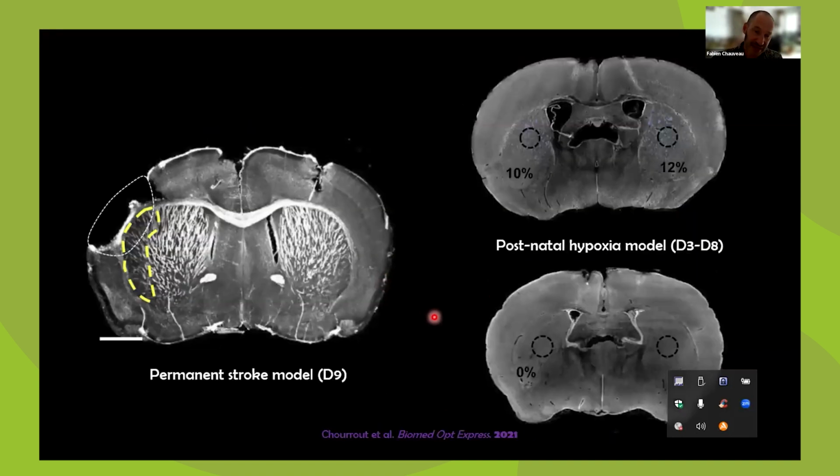A few medical cases where you can use this white matter contrast. Here in a stroke model, the lesion itself, which was necrotic, went away when getting the brain out and after the perfusion, but the necrotic part is not the interesting part. You can see here that the adjacent white matter has a loss of contrast, which indicates white matter damage adjacent to the stroke lesion.